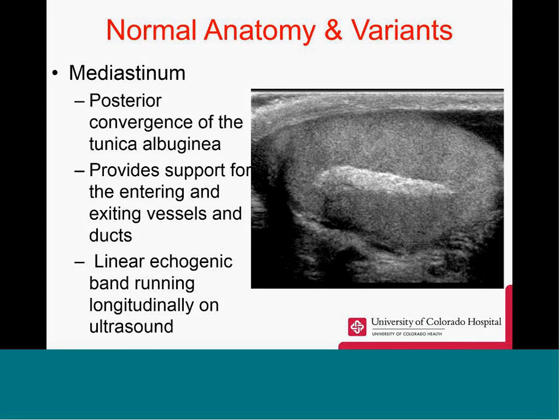The mediastinum is the posterior convergence of the tunica albuginea, seen here on ultrasound as a linear echogenic band running longitudinally. It does provide support for the entering and exiting vessels and ducts.